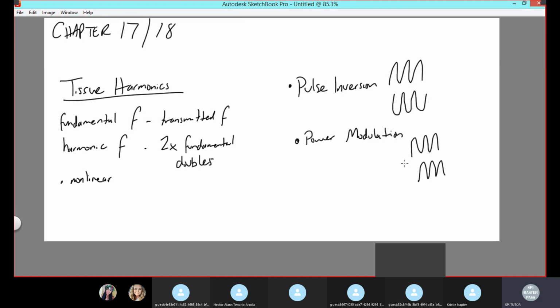You notice that in both of these technologies, two pulses are being sent out instead of one. And if you go back to frame rate and temporal resolution, and what affects them, the number of pulses affects it. If you have more pulses, you have to wait for all pulses to come back and do their job. And that was the key word, right? Wait. You have to wait. And temporal resolution does not want to wait, right?